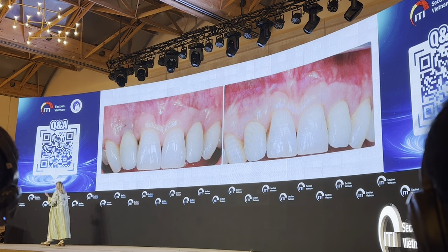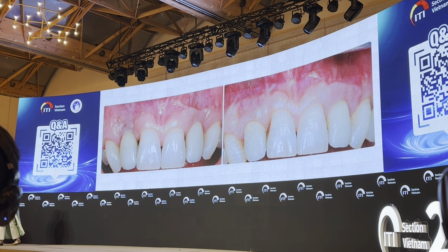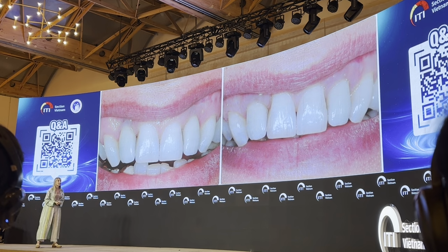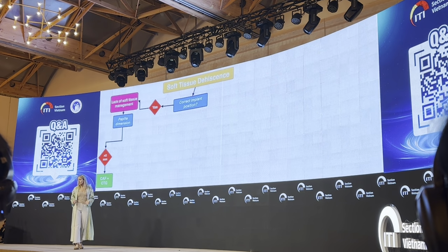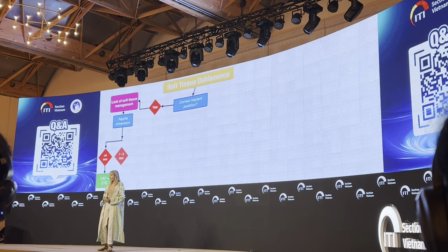So with a simple, straightforward surgical procedure, in this case belonging to class 2, we were able to solve this aesthetic complication for the patient, restoring the right situation.